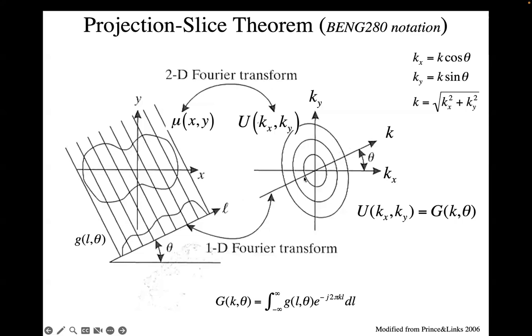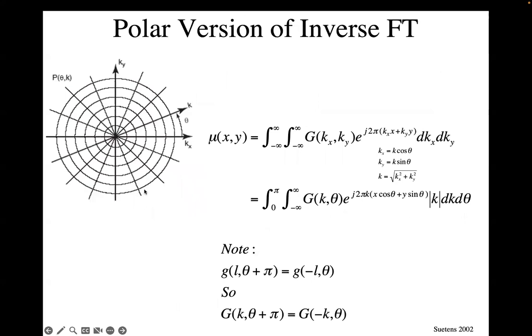And once that is understood, it becomes clear how we should do the projection reconstruction. We just can't project these back. We need to modify them. And I won't go into it, but it turns out that when you look at what does it mean mathematically to take these samples that are these radial samples in Fourier space of your image.